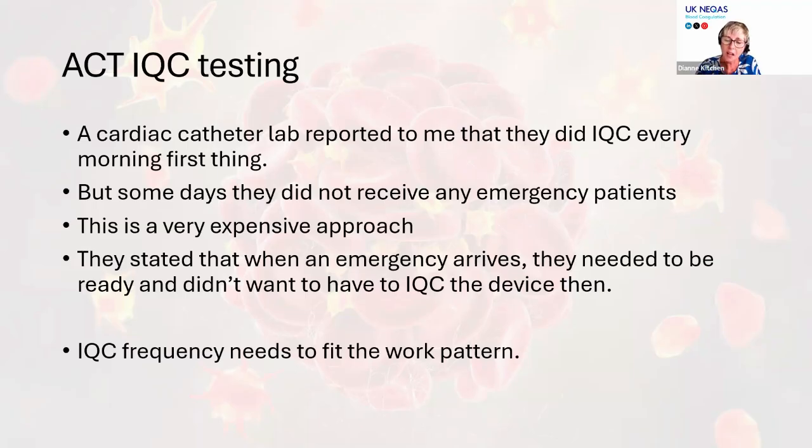So this really demonstrates that the IQC frequency needs to fit your work pattern. It needs to be applicable to what you're doing. And we can give guidance to that if you are struggling. Just email us with your specifics and we can try and give you some guidance.